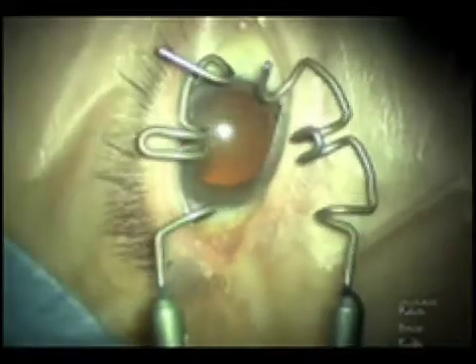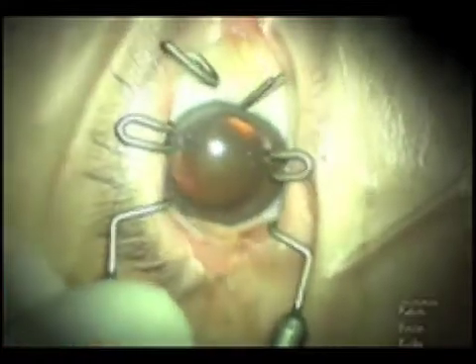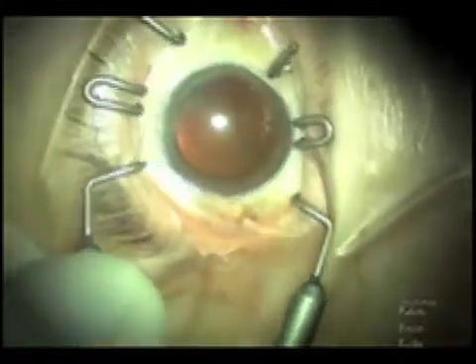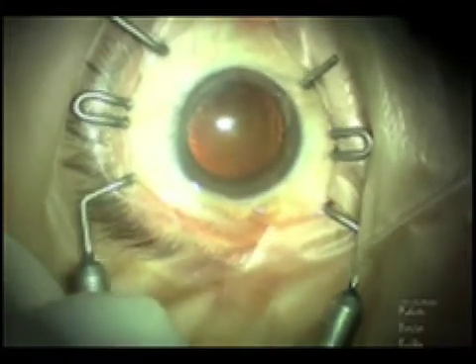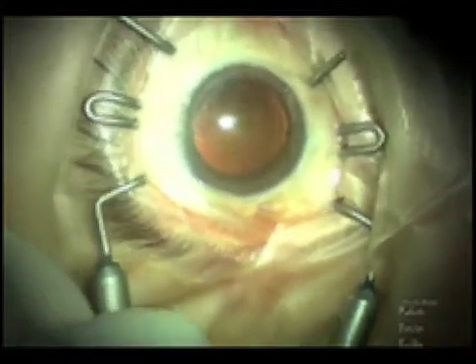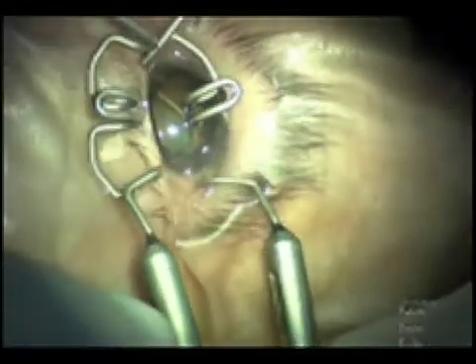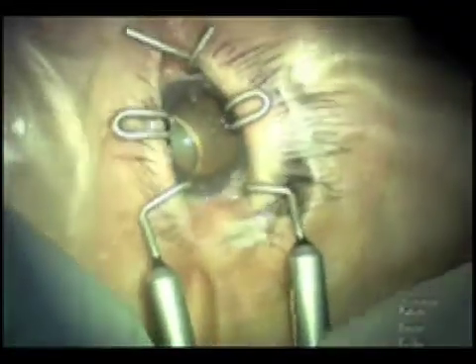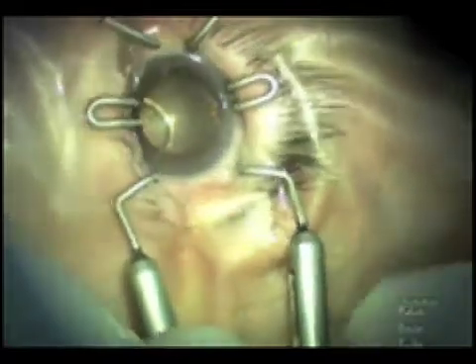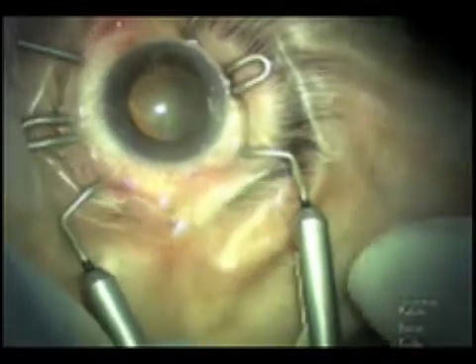Again, the superior blade is placed beneath the upper lid and then the inferior blade is placed beneath the lower lid. The mechanism is then turned to reach the optimal opening. The speculum is placed in a smaller eye. You can see that despite a small interpalpebral fissure, the oval configuration gives the surgeon excellent exposure.